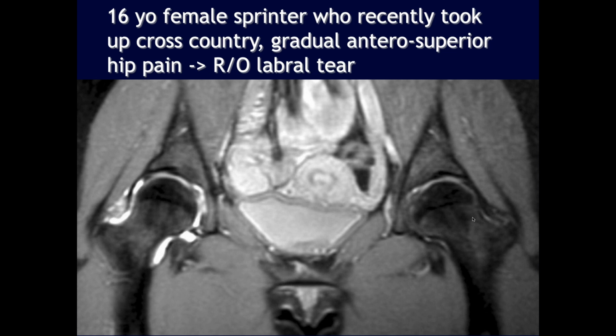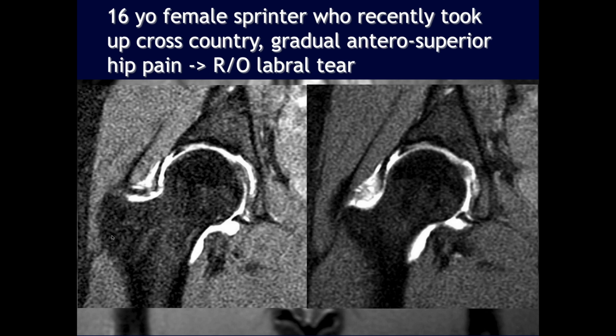Okay, so is this an arthrogram? Just a STIR. So we do have a hip effusion here. It almost looks like there's some fluid there along the capsule margins. And I don't know if there could be a capsular injury because it doesn't look intact there. There's the other side. Right. Since this is fluid and not an arthrogram, I'd be worried about capsular injury.